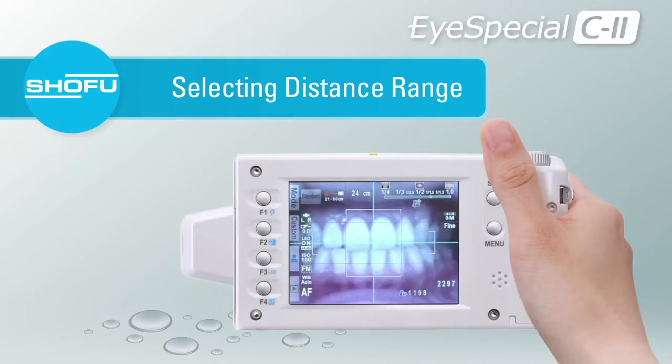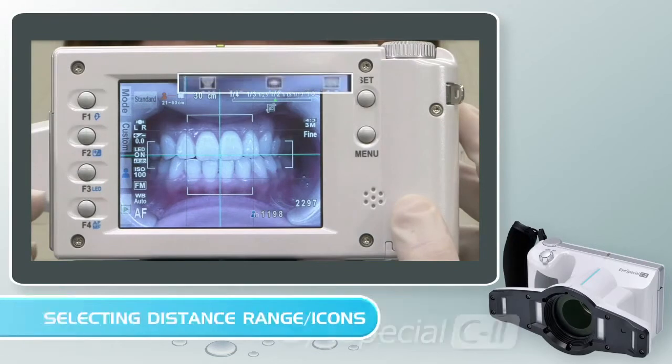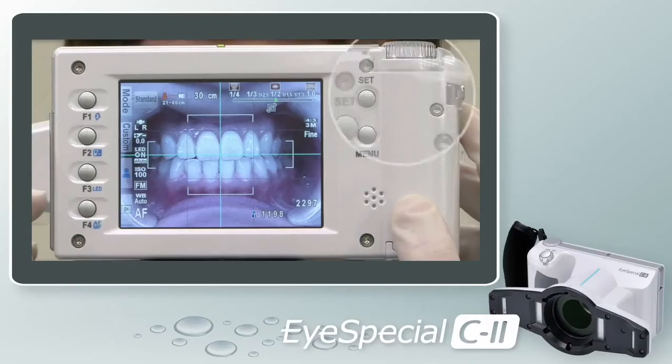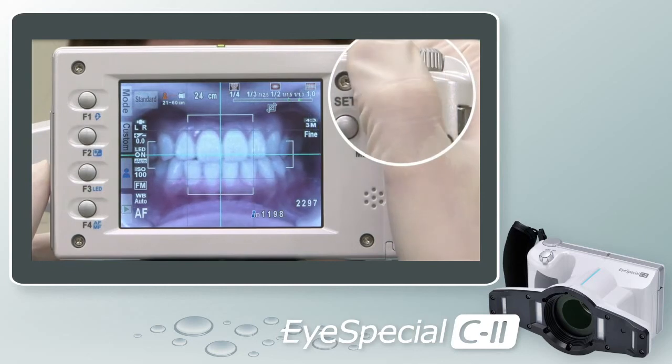Selecting Distance Range. At the top right corner of the screen, you will see three to four magnification range icons with varied distances. These are unique to each mode. It is important to select the proper distance for the image you are taking — depending on which icon or range you choose will determine how far back you must stand from the subject, ensuring clear, consistent, and reproducible images every time. To select one of these ranges, turn the thumb dial located on the top right corner of the camera to the right or left.